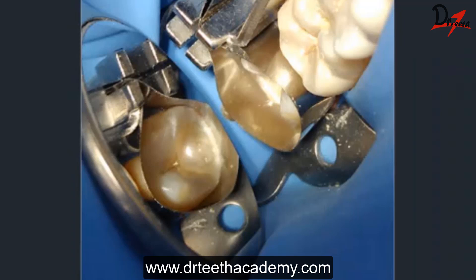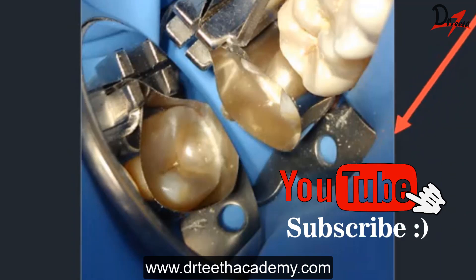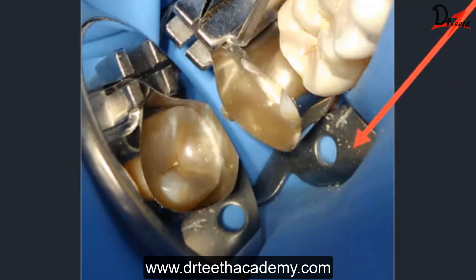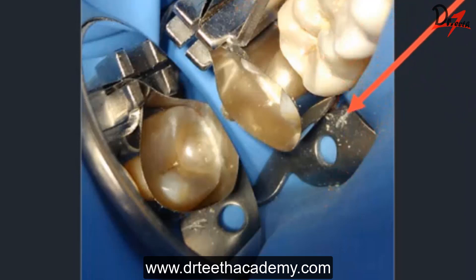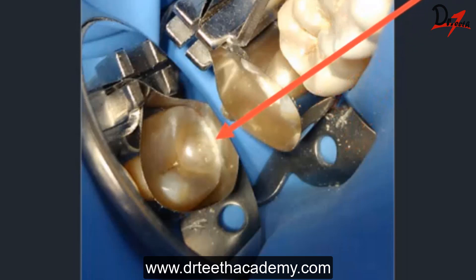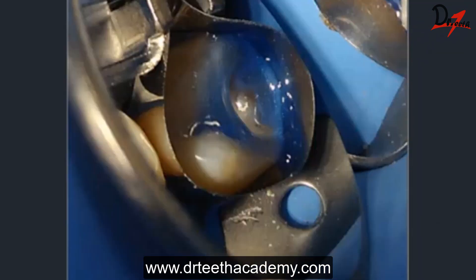In dental school we are taught to consider whether the Toffelmire should be kept on the buccal or lingual side. Usually without a rubber dam, you can't keep it on the lingual side because of the tongue. But when using a rubber dam with a Toffelmire, there is no issue with lingual or buccal positioning. The only criterion I keep in mind is tight adaptation — the matrix adaptation should be rock solid. No matter which side, as long as it is tight and snug, it is good.